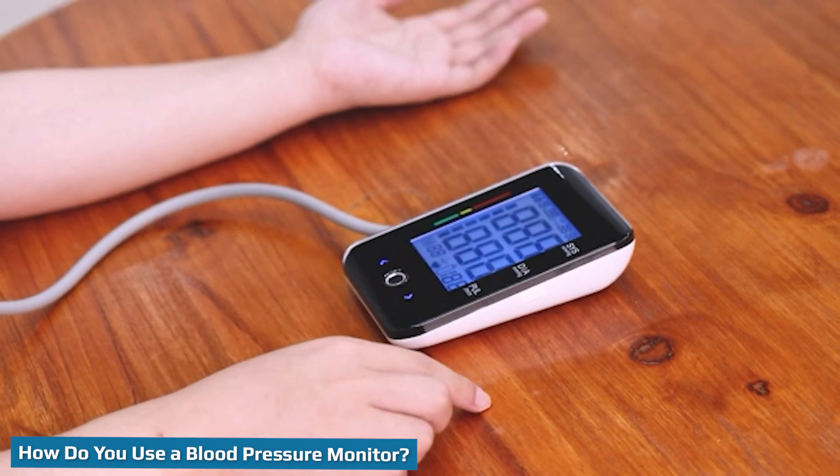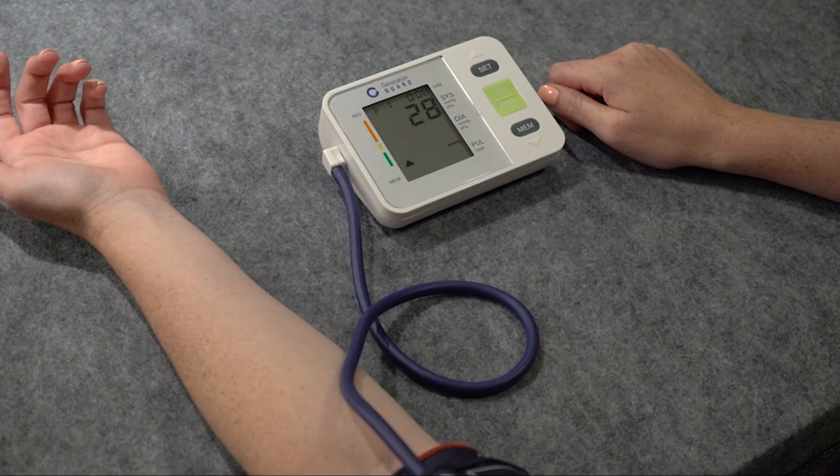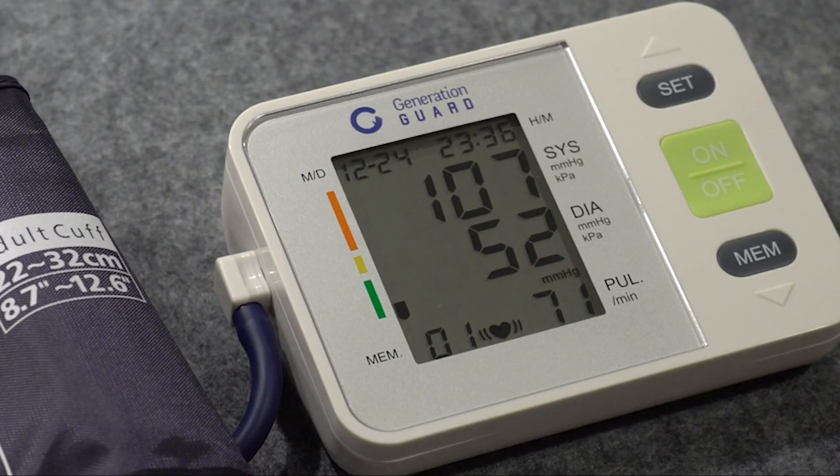Patients should avoid smoking, exercising, and drinking caffeine for at least 30 minutes before they take their measurements, as these activities can all increase heart rate and affect blood pressure. They should sit quietly for at least 5 minutes before using the blood pressure monitor. Patients should sit straight up on a chair with good back support, with their upper arm at heart level and their hands supported, not lifted in the air. They should sit with their legs uncrossed and their feet flat on the floor.